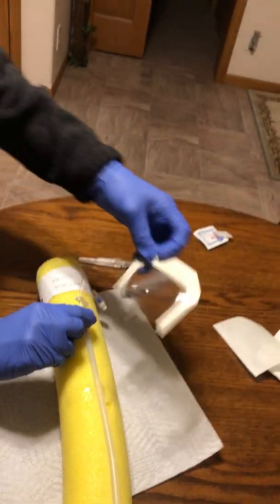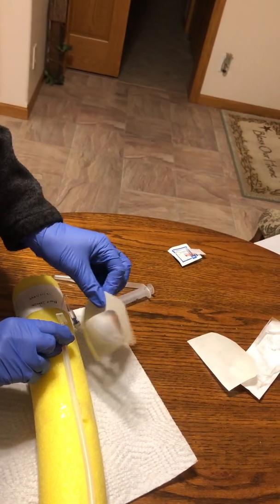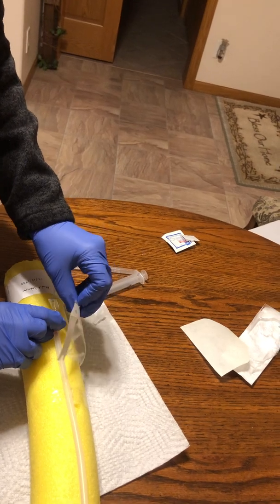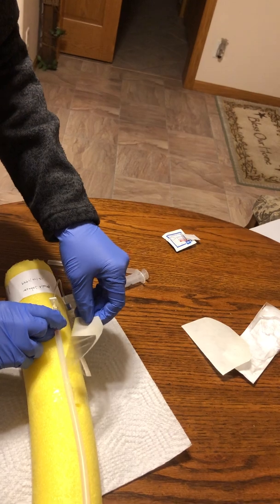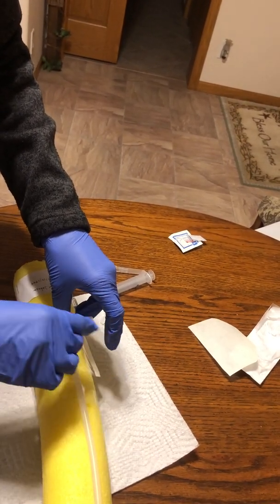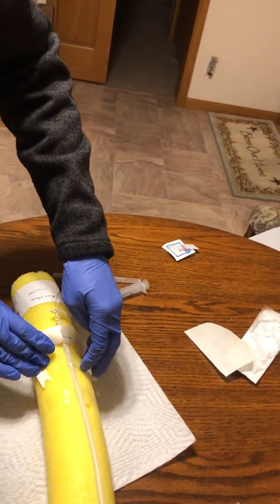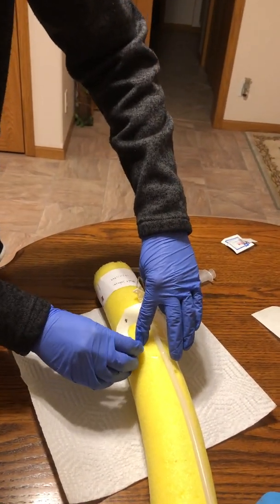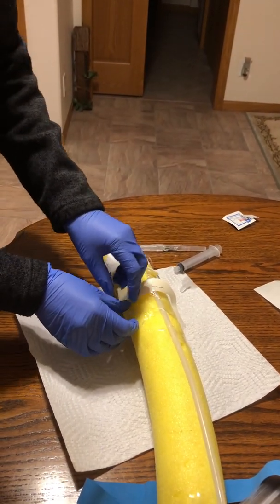Over the site, keeping it stable. And it goes over the pink part. Good, so I have it on there. And then what I want to do, make sure I'm nice and careful because I don't want to move the needle in the patient's arm.